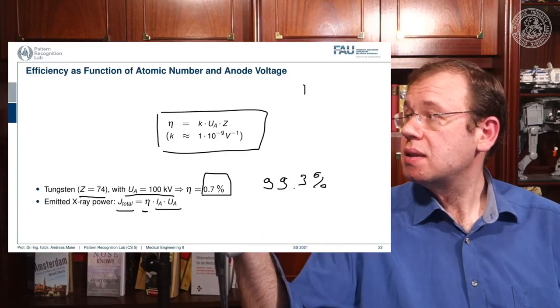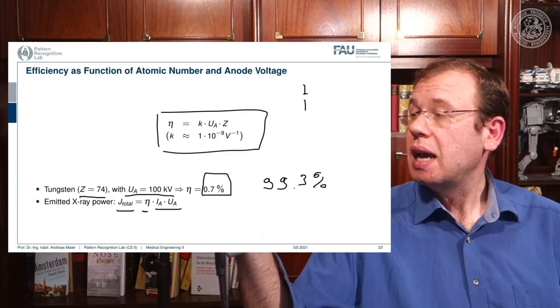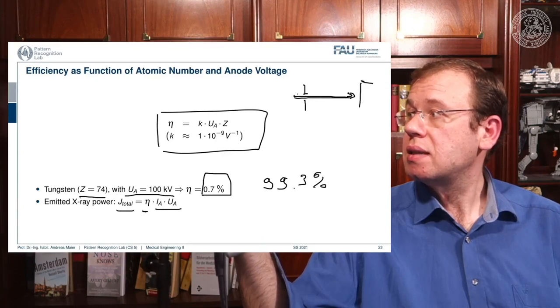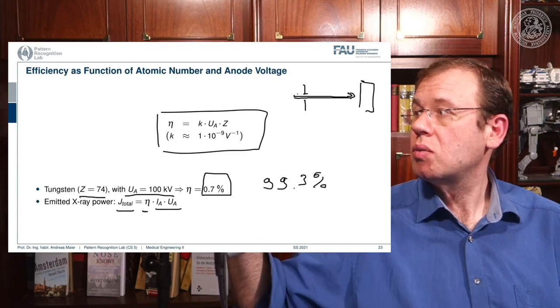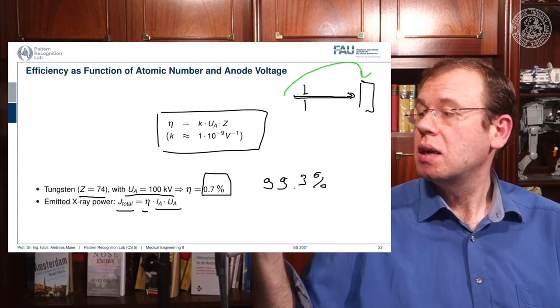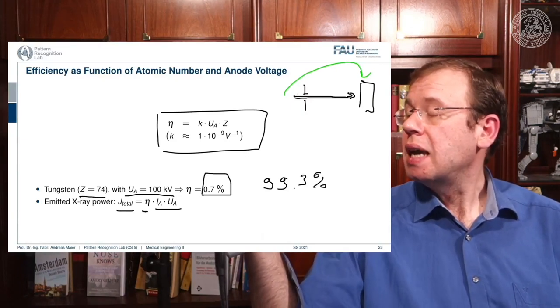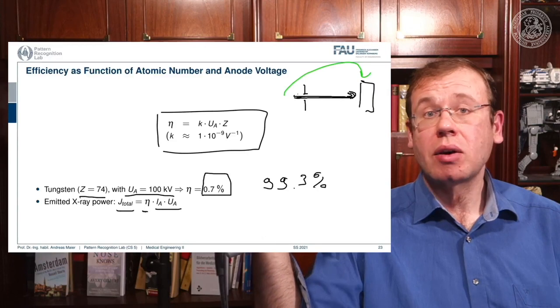So they have a nozzle. So here you can see a schematic of a nozzle. So it's very thin. And then they have a stream of liquid metal. And you, of course, have to have a laminar flow here. And this then is taken up in a basin. So probably you want to rotate this in this direction here, because then the flow is going downward and not to the right-hand side. And then what you do is you use this entire stream of liquid metal as the anode.